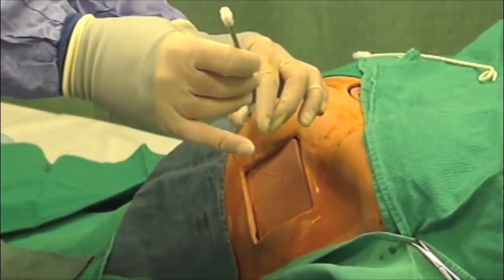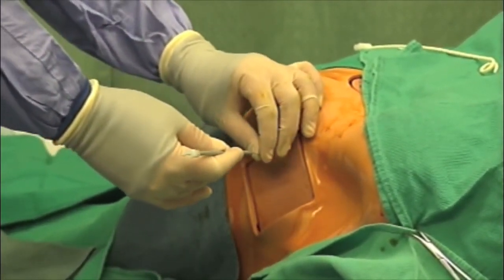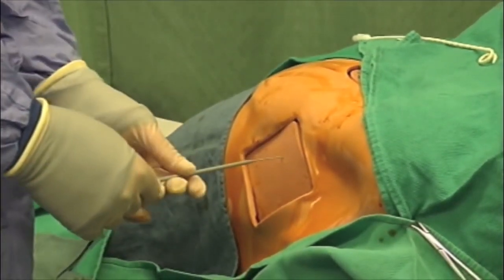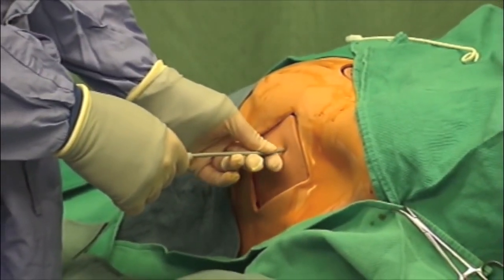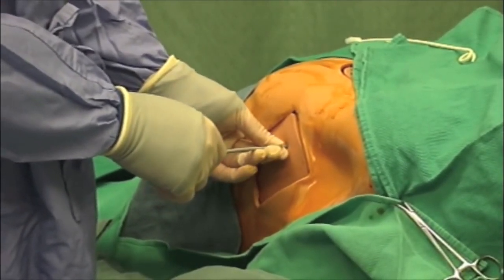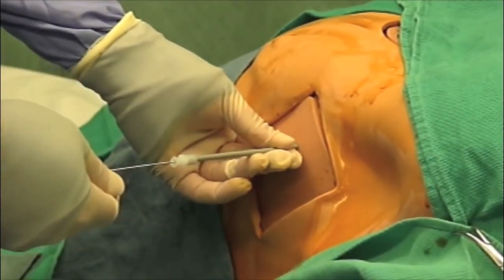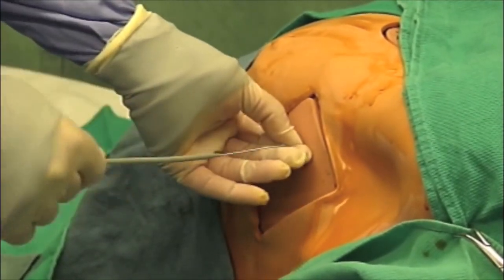Thread the dilator over the guide wire to the depth determined by the seeker needle used for local anesthetic. Remove the dilator, leaving the guide wire in place.